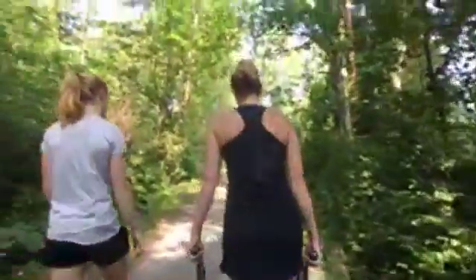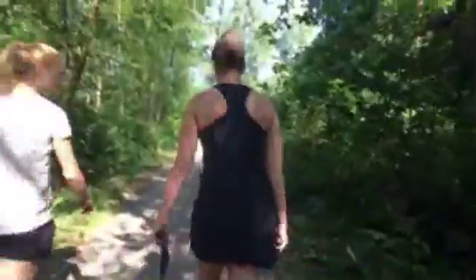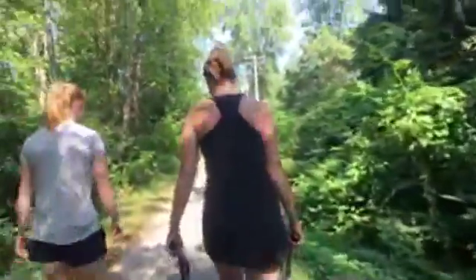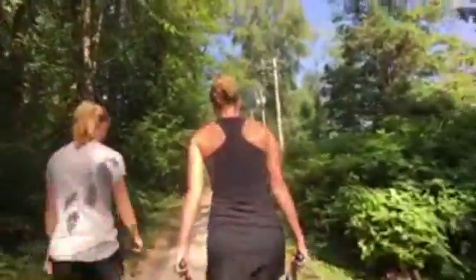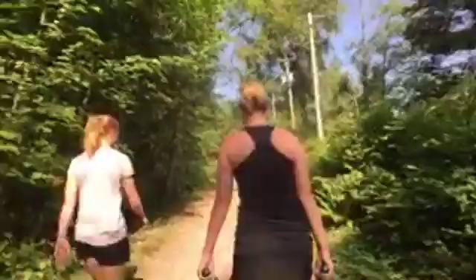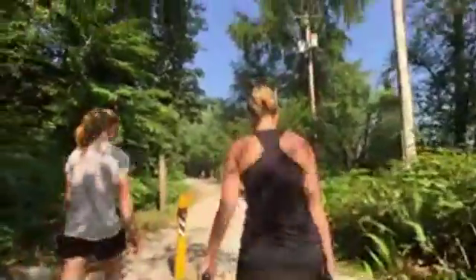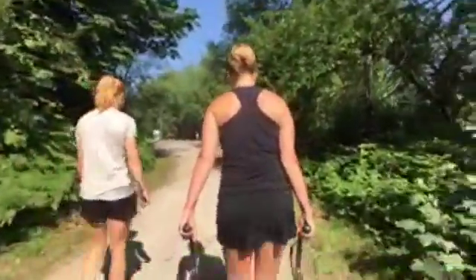So again, at this point, I feel very comfortable. I don't feel like I'm leaning in any way. I should mention there is a wheel underneath me, so if they didn't need to lift up, that's how it works. For anybody who's using the Trailrider or would happen to rent it on their own, we do rent it. It's a wheelbarrow wheel underneath, and you never want the wheel too inflated because the wheel, of course, is right underneath my butt, and you want the wheel to have some give in it, especially if the Sherpas need to lift or roll me over something. But as you can see in beautiful Pacific Spirit Park, it's pretty easy going.